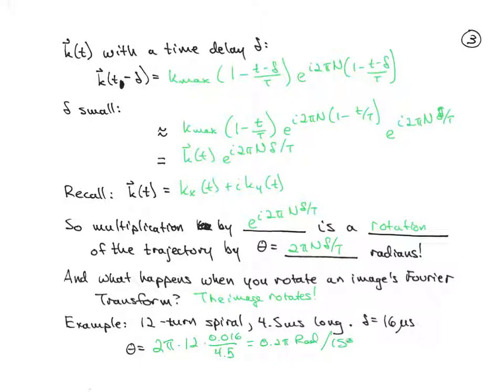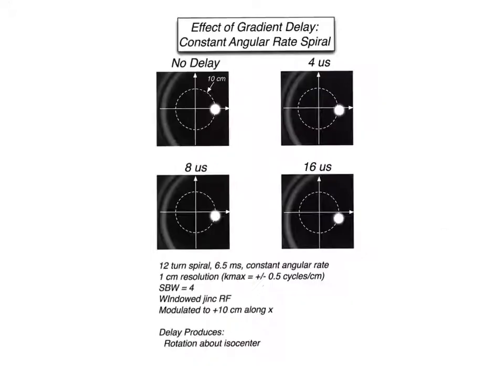This is something you're really going to notice. And you're going to especially notice the rotation if you're exciting a pattern with any kind of asymmetry with respect to the center of the field of view. Since if you're exciting a circularly symmetric pattern with a spiral RF pulse in the middle of the field of view, you're not going to notice if it rotates.